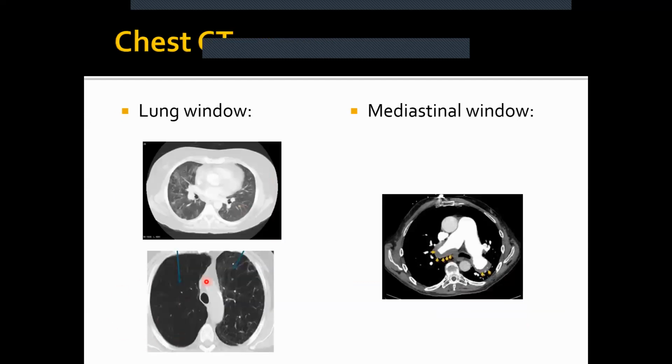So in this case, if you have your lung, you want to see all of the bronchioles. But the issue is that you have all of your bronchioles and all of your alveoli, and they're very, very similar looking, right? You need to be able to tell those apart, and separate them from the parenchyma. If you increase your range, you're going to find that doing that more difficult. But it also allows you to separate stuff like lung tissue from bone, for example, through increasing your range.